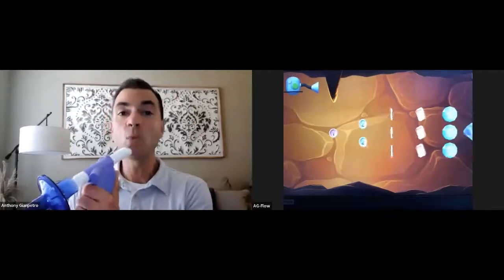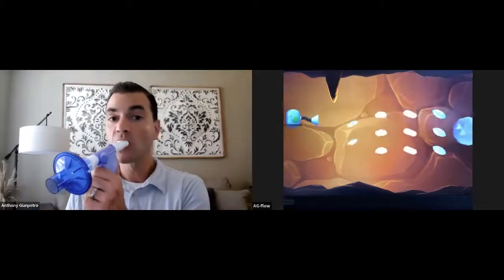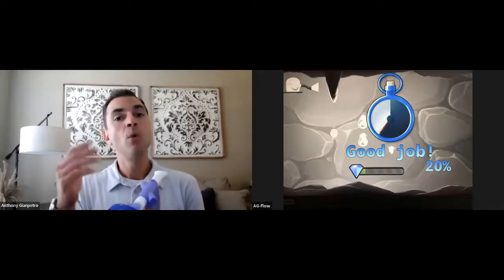If I give a very weak effort first, see, I'm not generating enough pressure in that effort to get past the minimum inspiratory setting that I have it at, which is around 1. 1 is the highest, by the way, for that, which means that I didn't get everything that I needed for the volume.